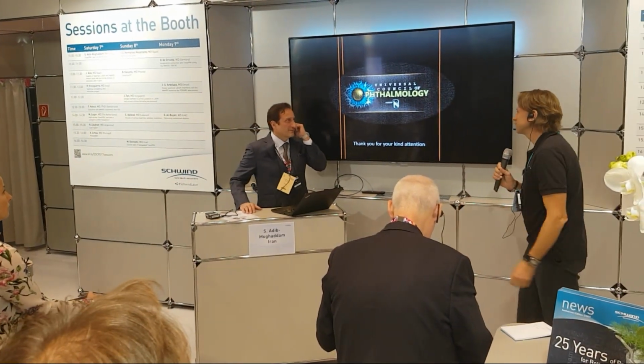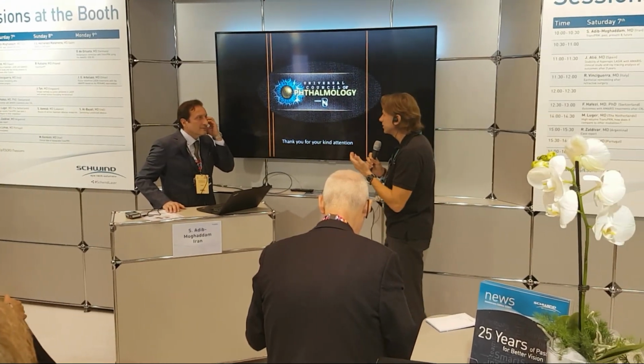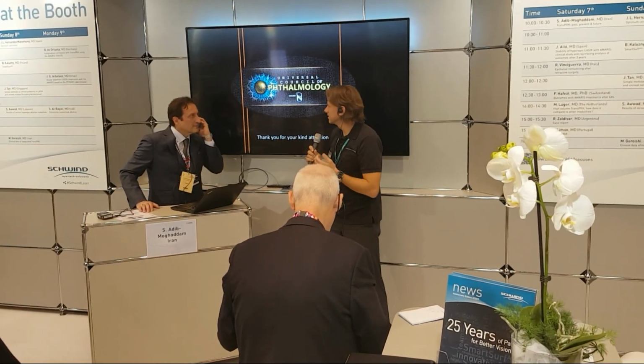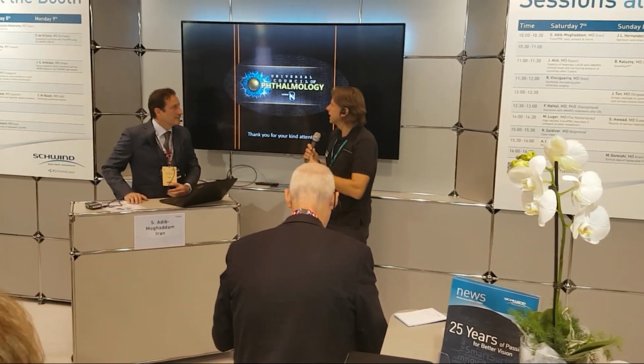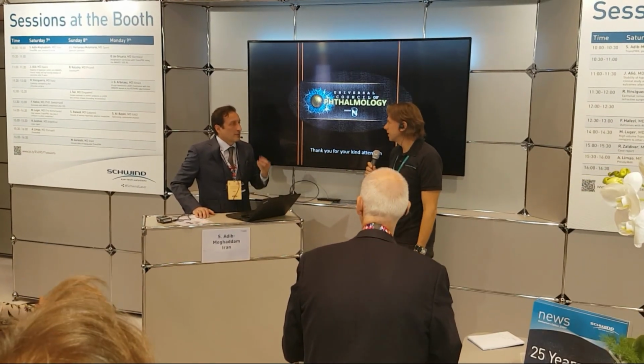Some more questions here from the group? Maybe I have a question. I heard that many give a bandage lens postoperatively. They put in Voltaren or something to reduce the pain. Are you doing something like that?